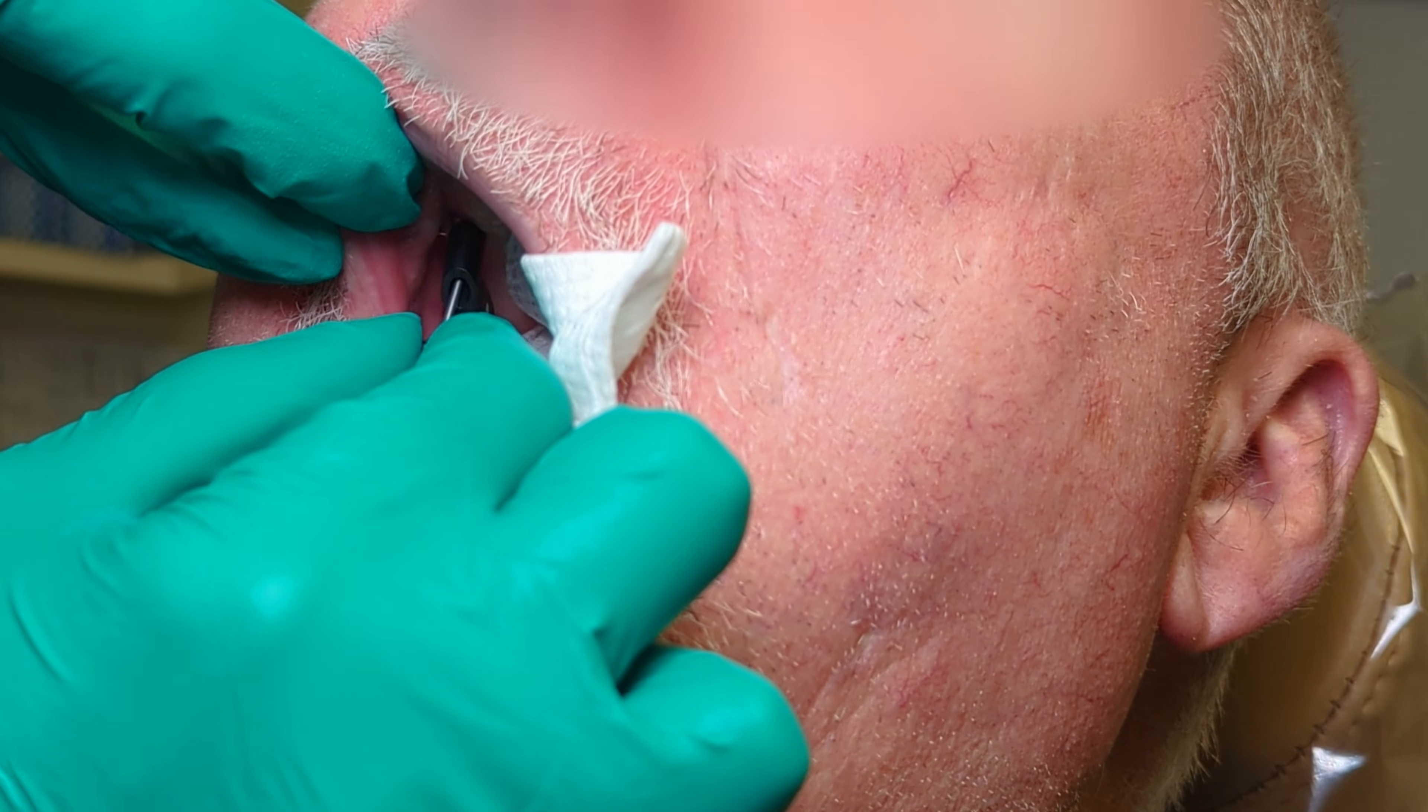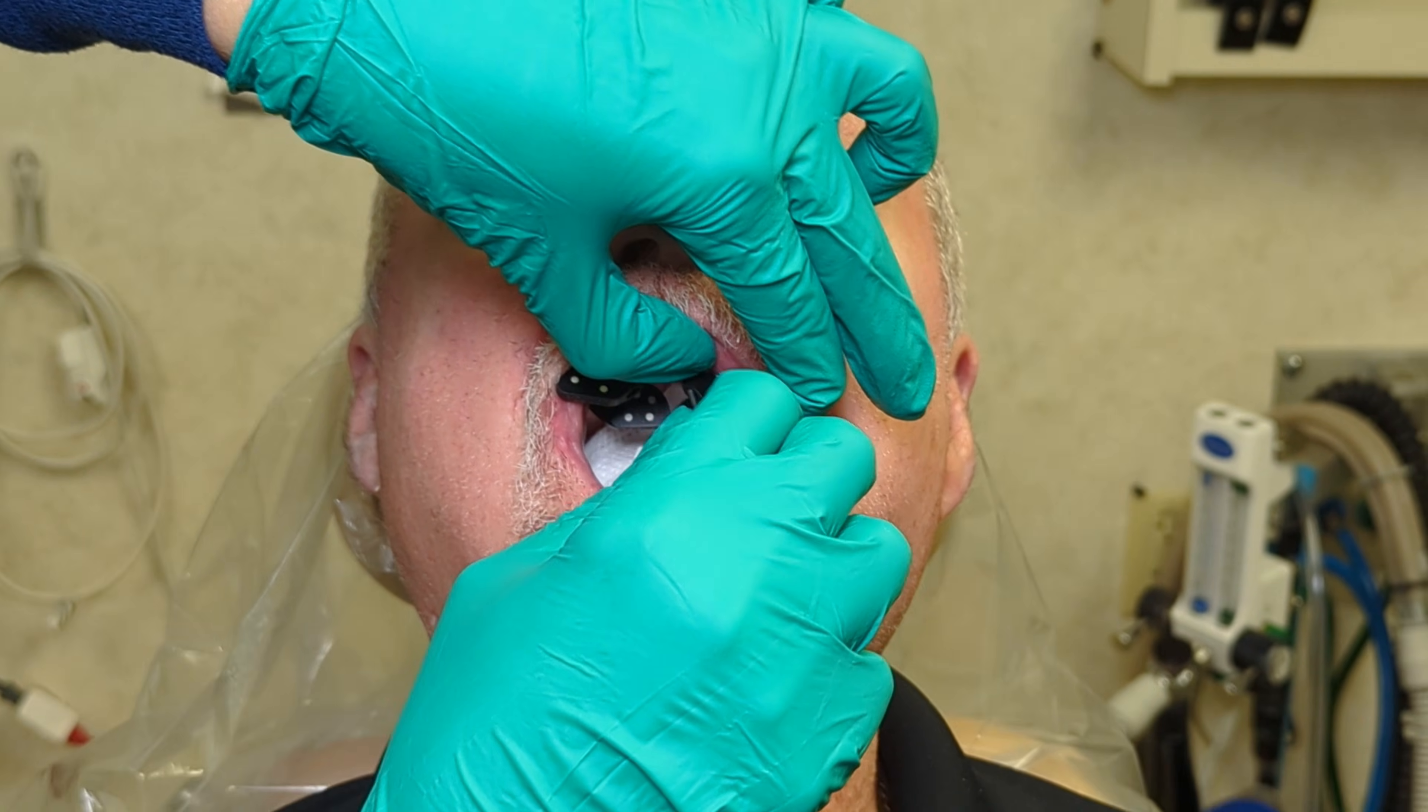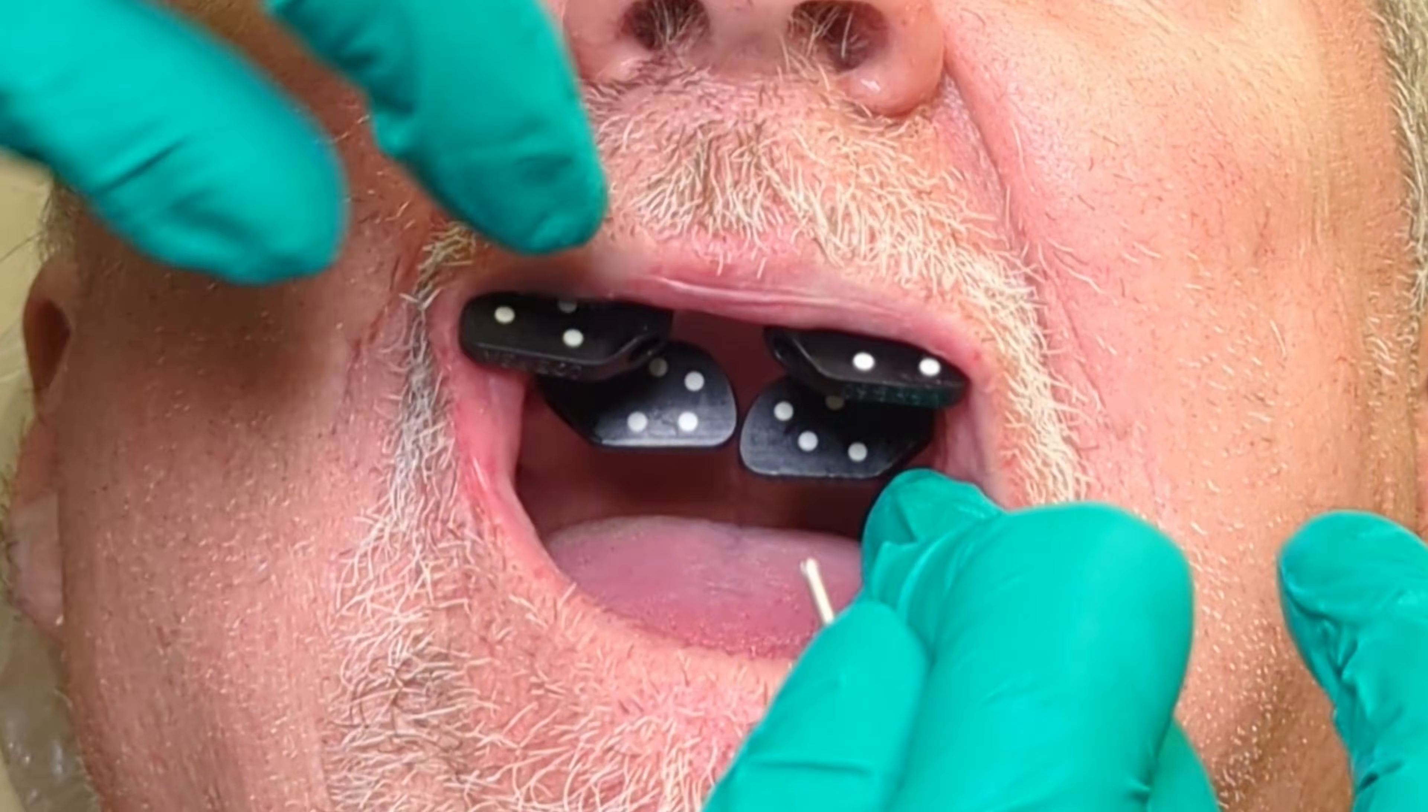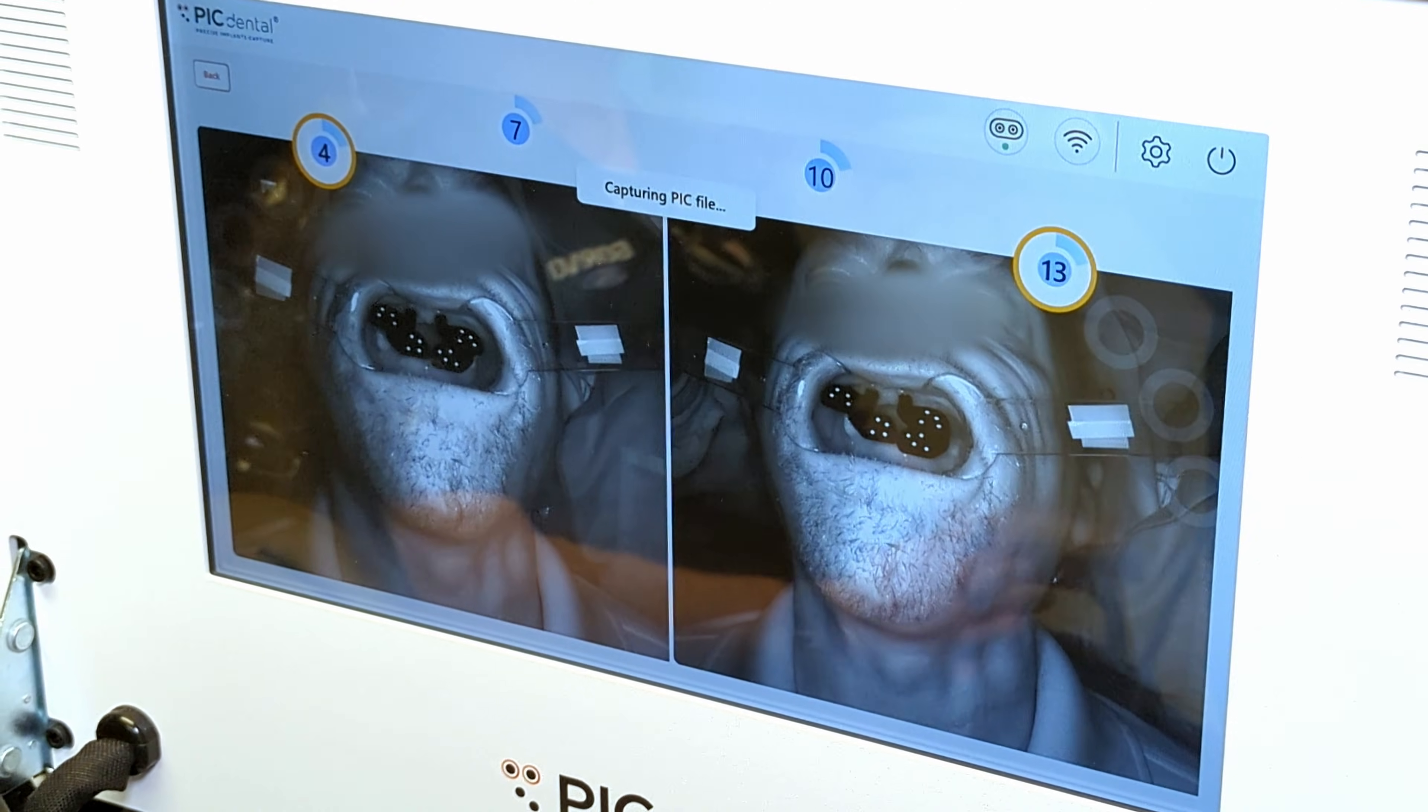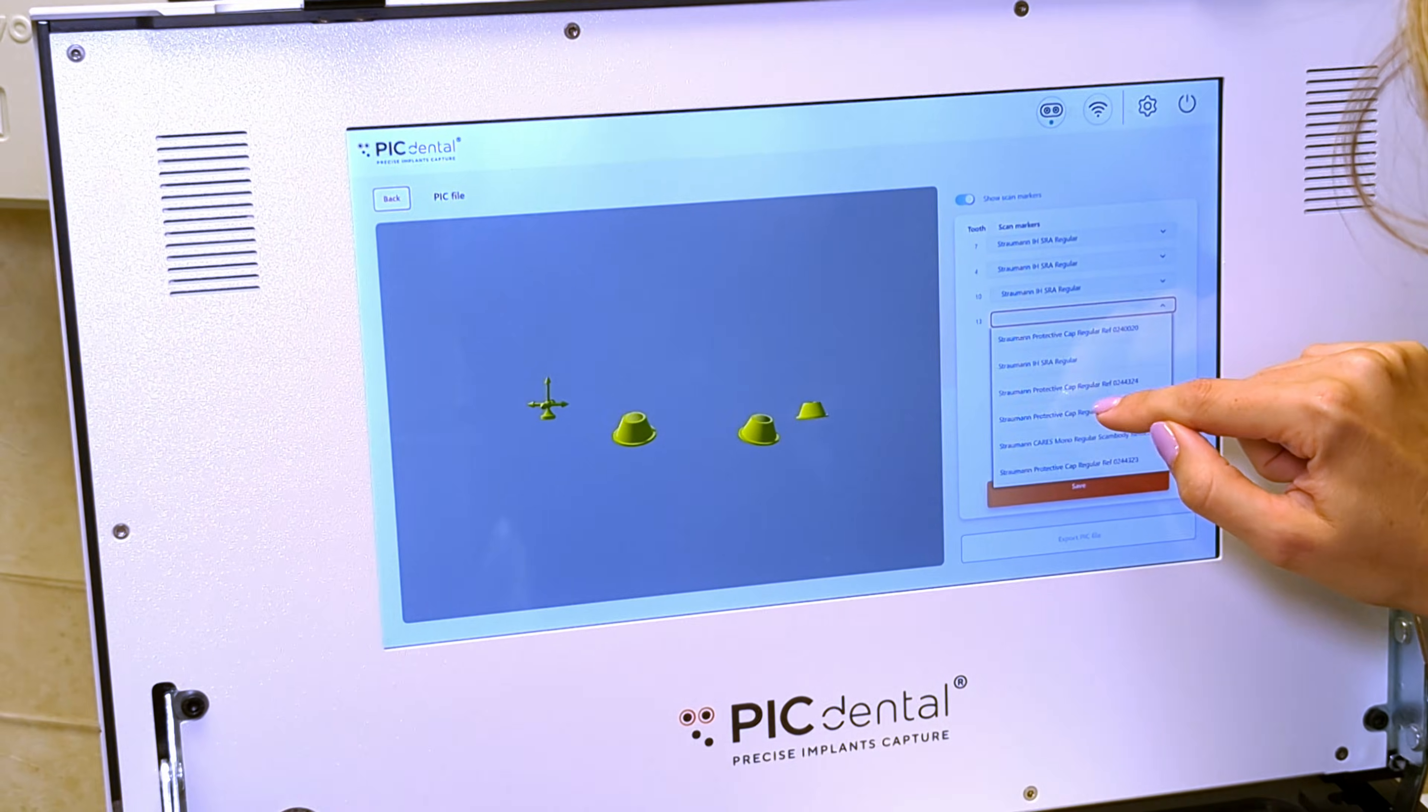All the scan flags are positioned onto the multi-units in the patient's mouth in the order they were initially organized on the tray. Hand-tighten them and tilt the flags so that all the dots are visible from a straight view. Using retractors to open the patient's mouth, we then use the photogrammetry camera to capture the position of all the flags. The position is then output as an STL file reflecting the specific situation in the patient's mouth.